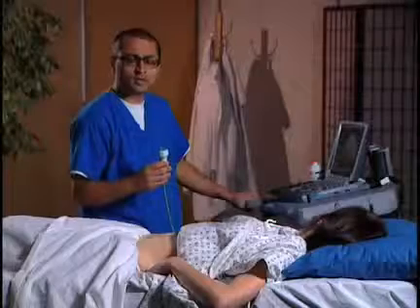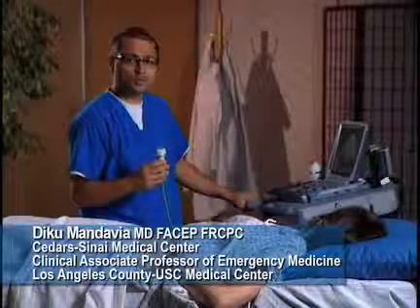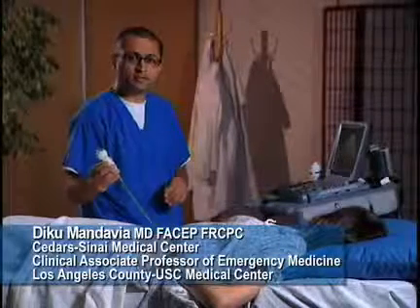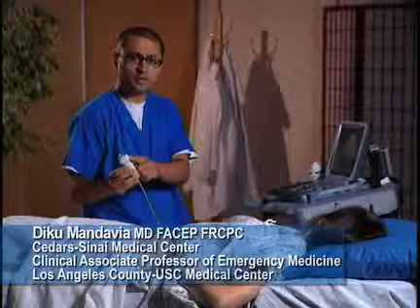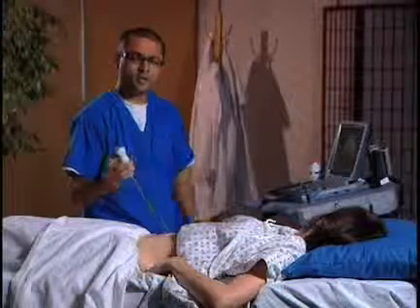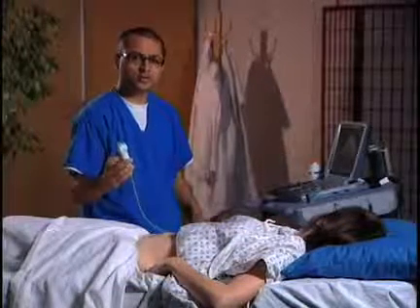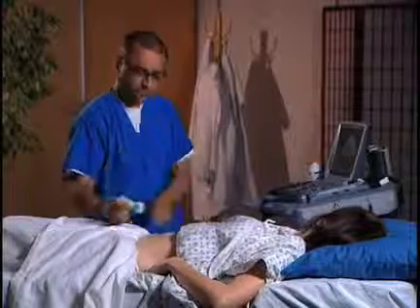We're going to do the FAST exam, the pelvic view in a female now. We have the phased-array transducer. Here's the probe marker right here. We're going to start off with a sagittal view, and ideally the bladder is full.